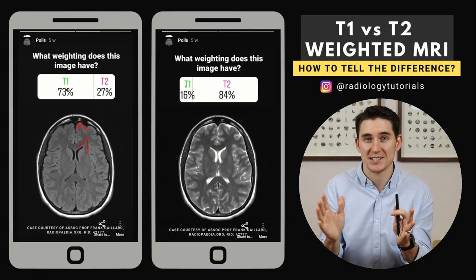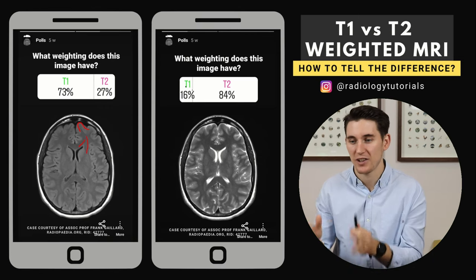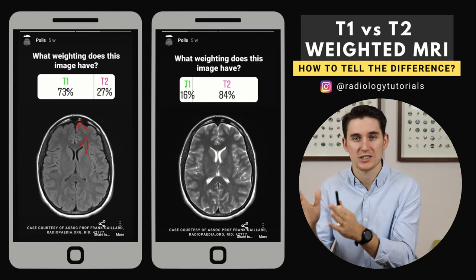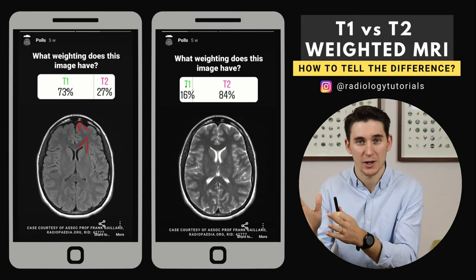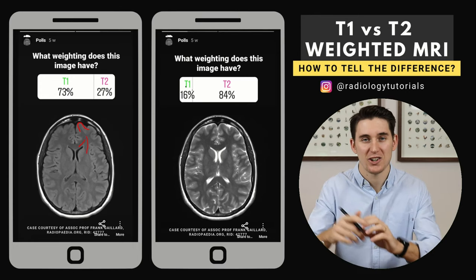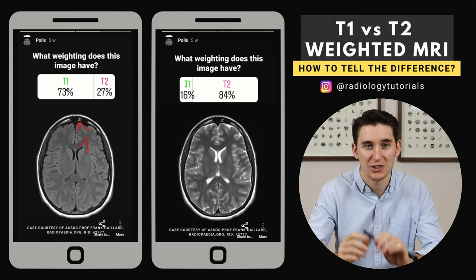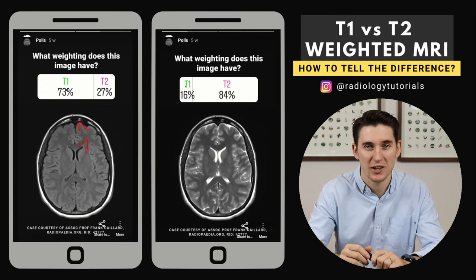It's really that simple. Avert your eyes away from the CSF and just glance at the gray-white matter interface. If the gray matter is darker than the white matter, you know you're dealing with a T1 weighted image.